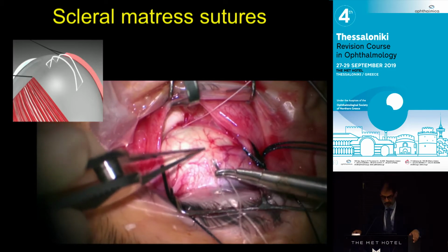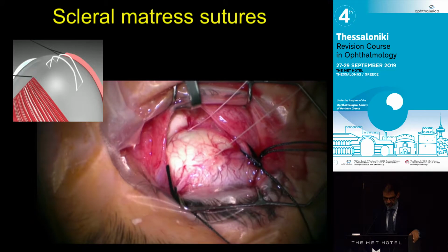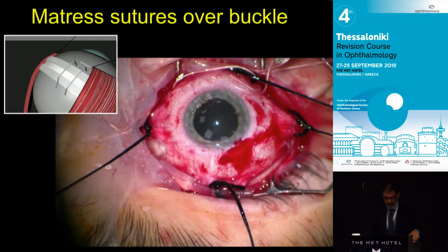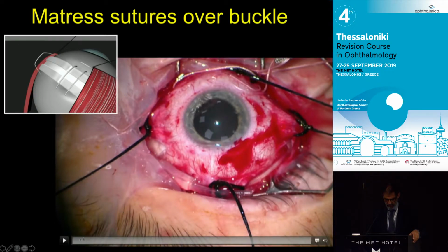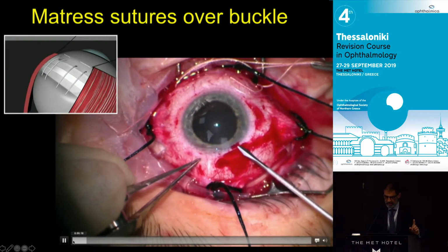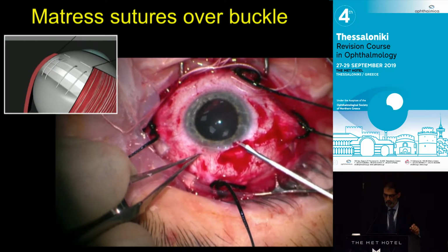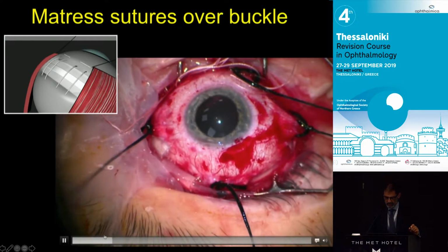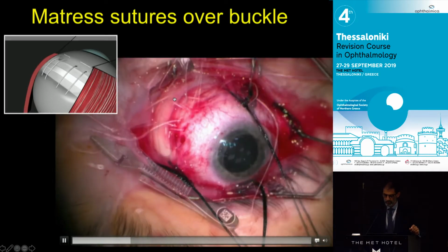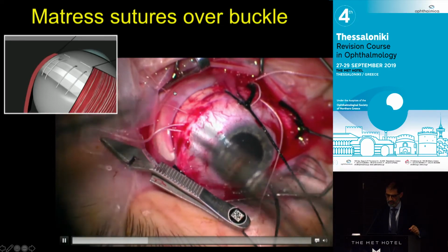And let's move along. This is just a standard buckling position here, and there you go. That's your mattress suture. And then I'm going to show you tying up the buckle. I'm just going to advance this so even faster than it is. Make some space first. So I do the paracentesis or the drainage before you pull the buckle into indentation. So that's what that was. Actually, this is going pretty quickly. There's the buckle threaded through, and we tie a triple throw here to indent.